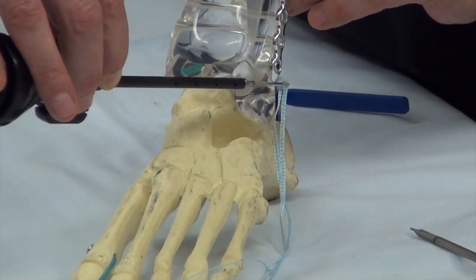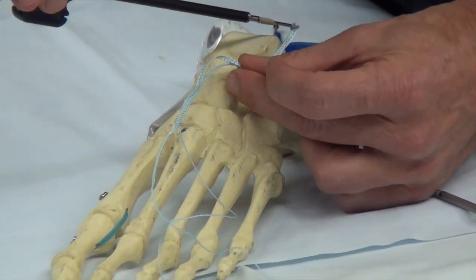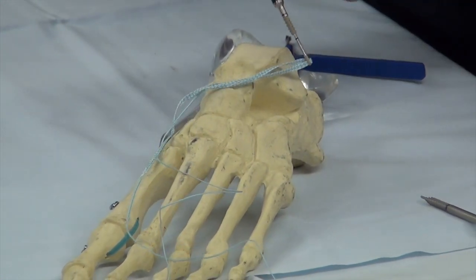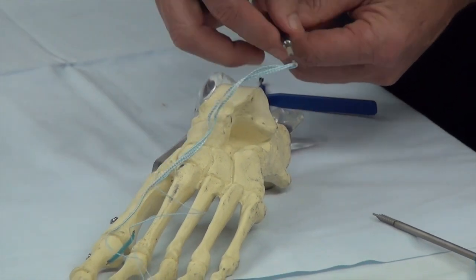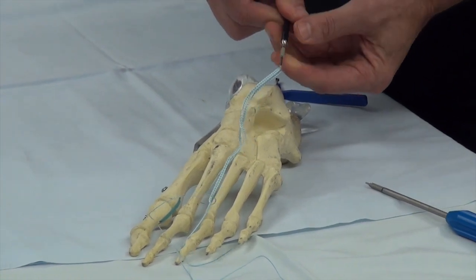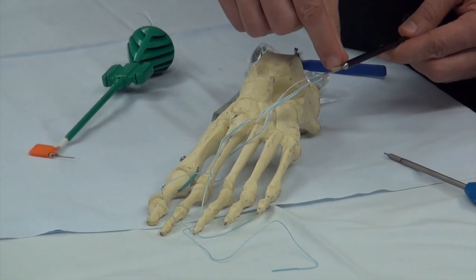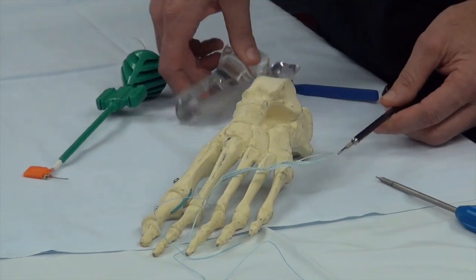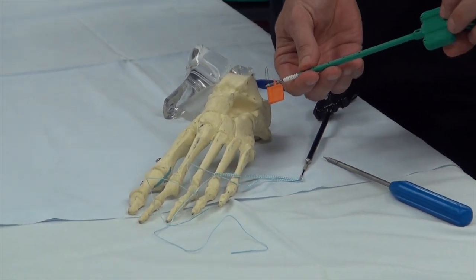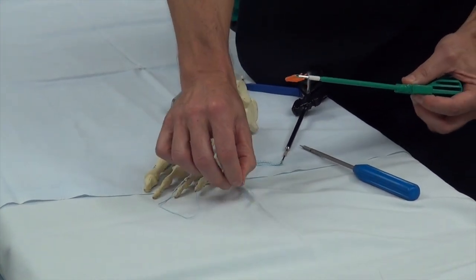Once it's buried into the fibula, this double strap will now be tagged in — hence the internal brace — to this side of the talus. Once this is in, the actual threaded device will be sunk into the fibula. It drags the brace in with it and exits the side here. Then when we finish up the talus with this device and drill it in, this wire passer passes the two ends through.